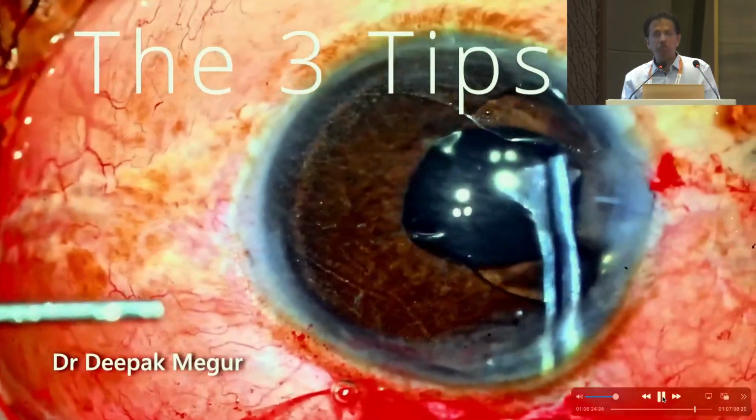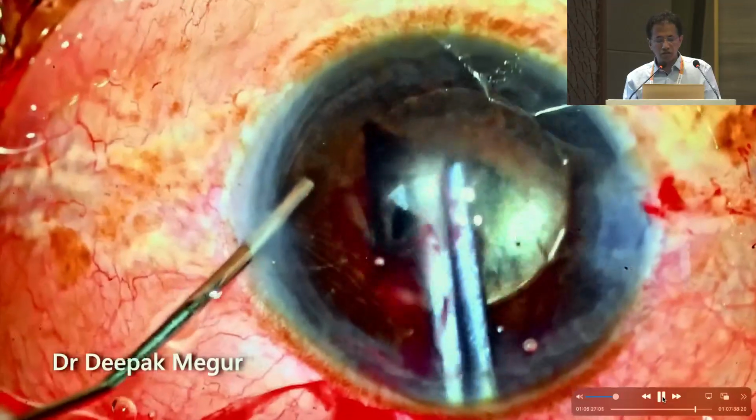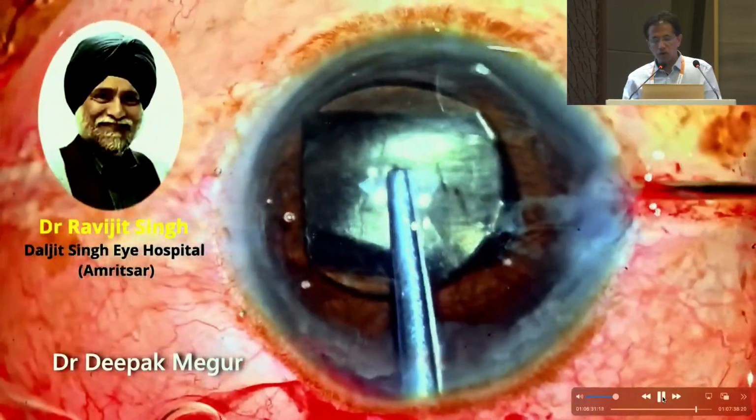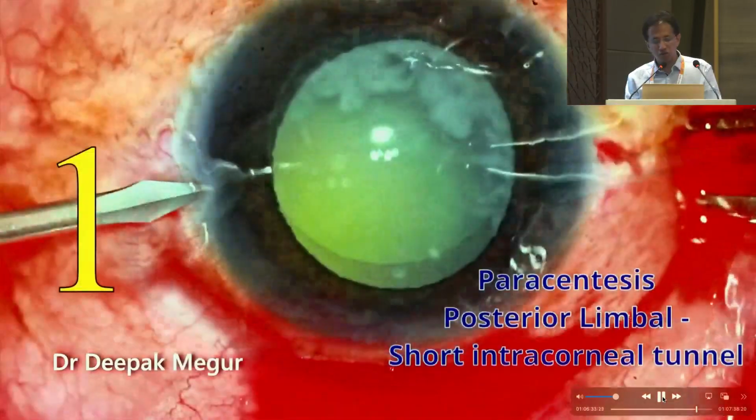So the 3 tips which I'd like to share with you, which I have learned from many of my colleagues and seniors, are to make small, short side port incisions, to mark them and then make them.